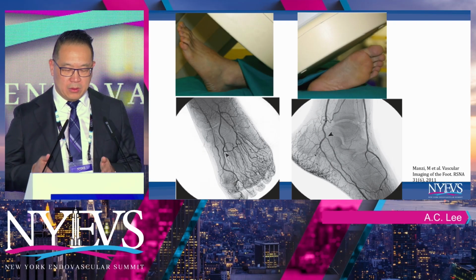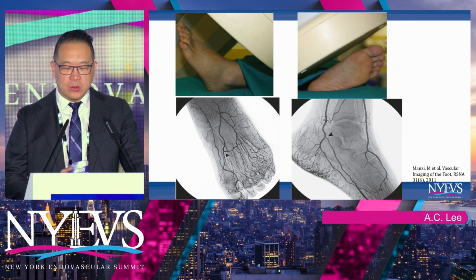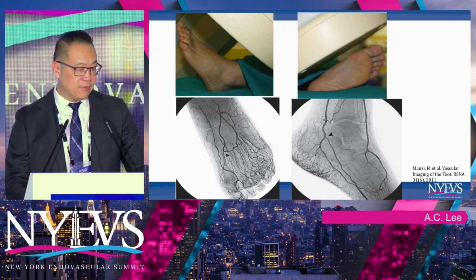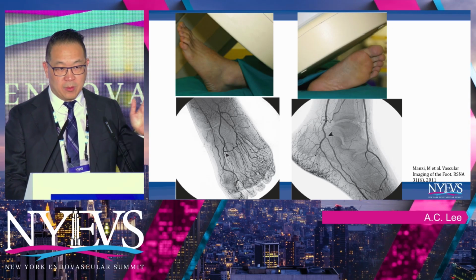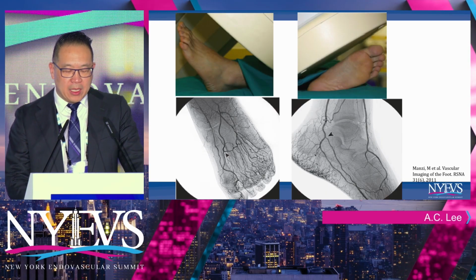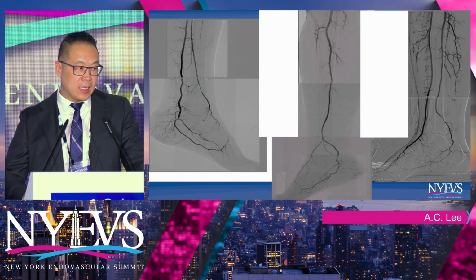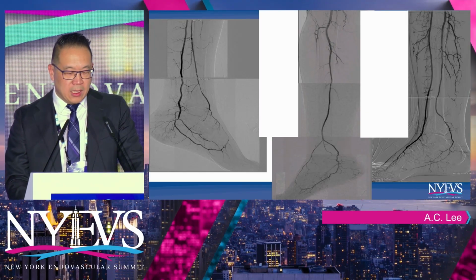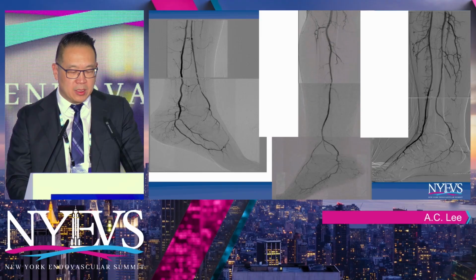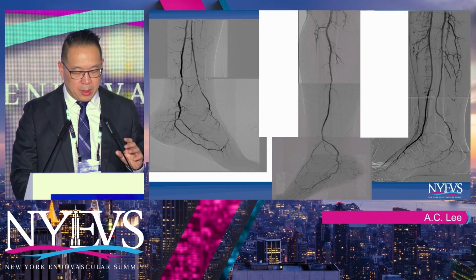I see a lot of people who are doing footwork, they're just taking a straight AP shot. But what you really want to do is take these two angles, because you can see the plantar arch looks very, very different. I think Fadi has a good slide where he transitions from the lateral to the cranial shot, but it looks very, very different. So you might be thinking that you're in the right place, but if you flip the camera, you're in the wrong place. Again, anomalies are really common. 10% of patients have tibial anomalies. So here you can see different supply of the foot from dominant peroneal arteries.